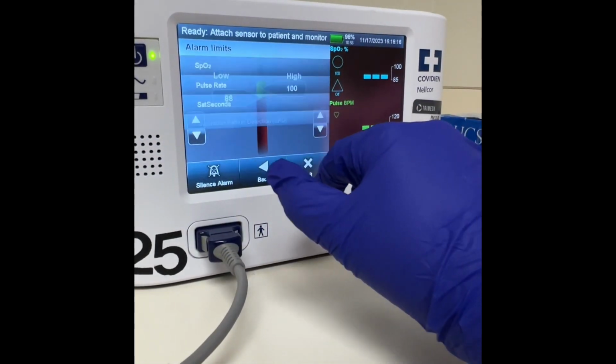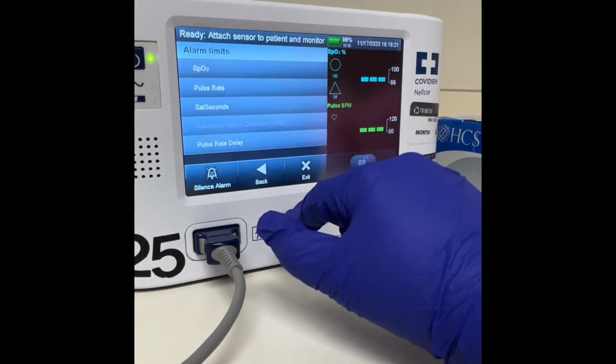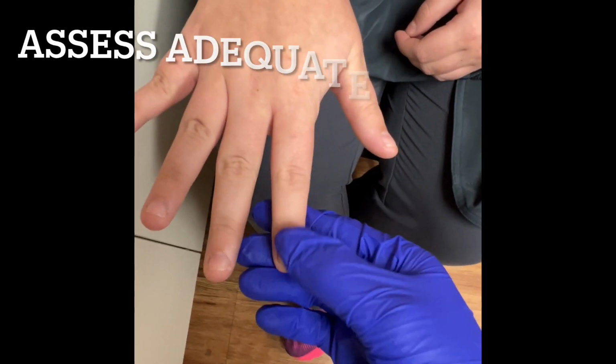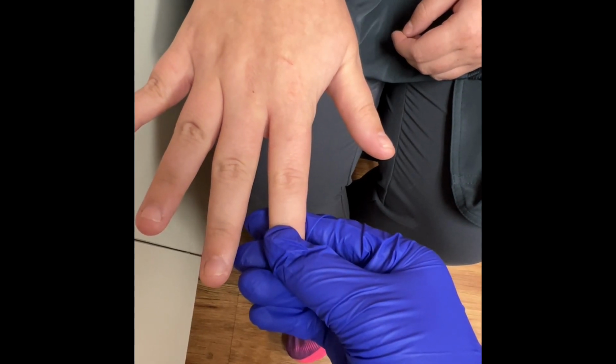Here I am setting the SpO2 at 88 as a low and leaving the heart rate as it is per hospital protocol. For my probe placement, I chose the finger, but you may also see the ear. To assess adequate perfusion, you can use the capillary refill test.